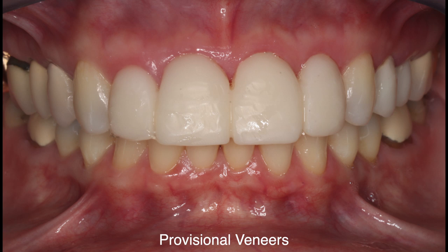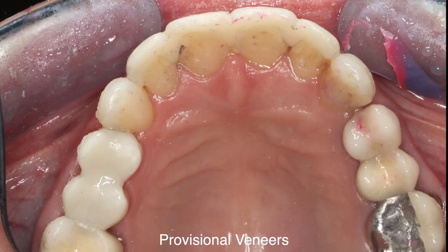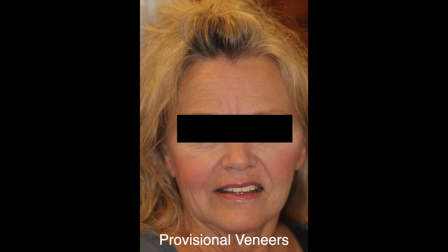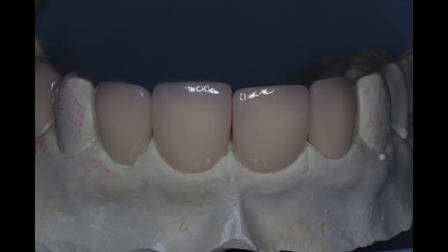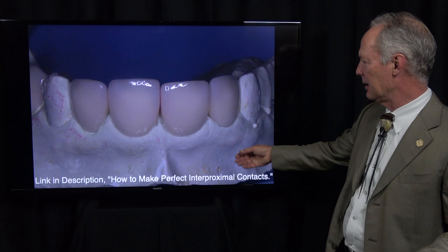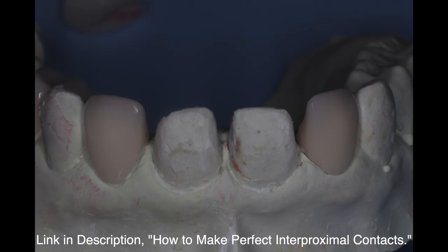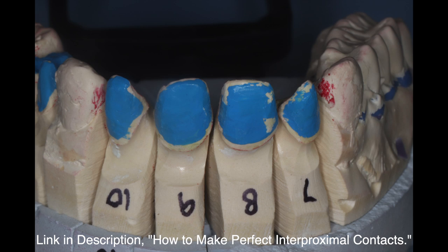So these are the provisionals. You can refer to that link. And these are the final restorations. They're on a solid model. Refer to the link on how to make perfect interproximal contacts. You do that on a solid model. And then this is a die model.